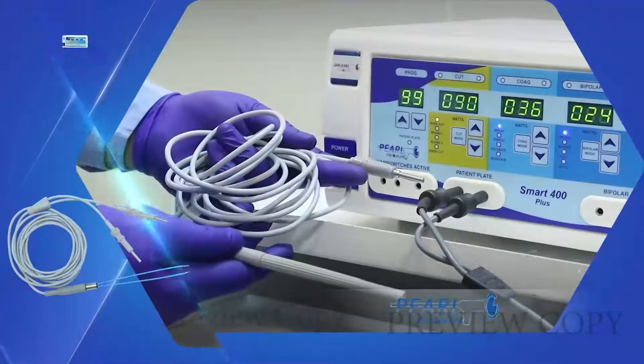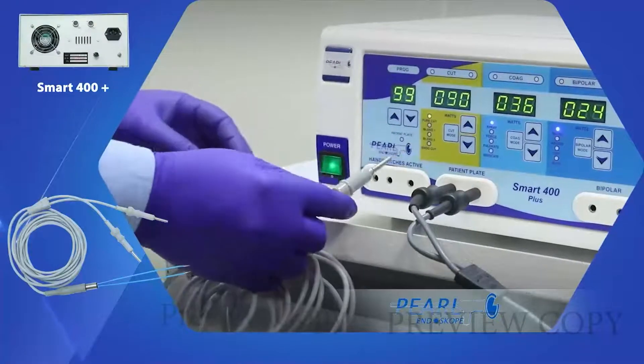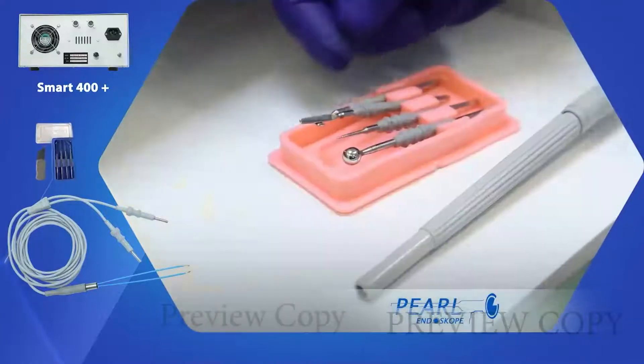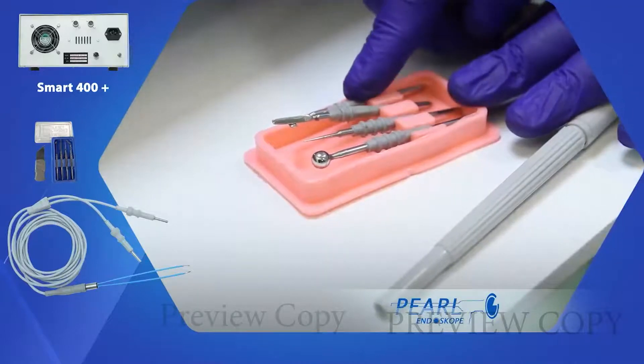We can set up the blades as shown in this demonstration. The required blade is chosen.